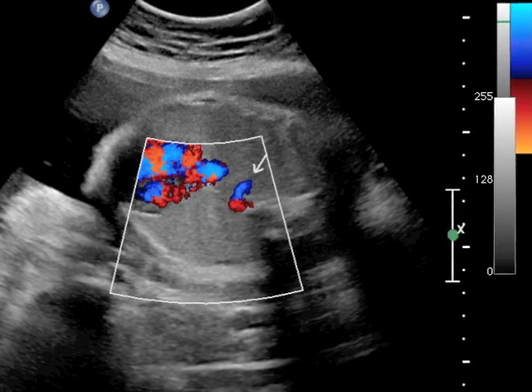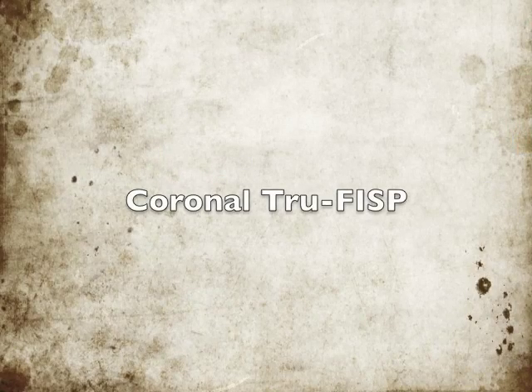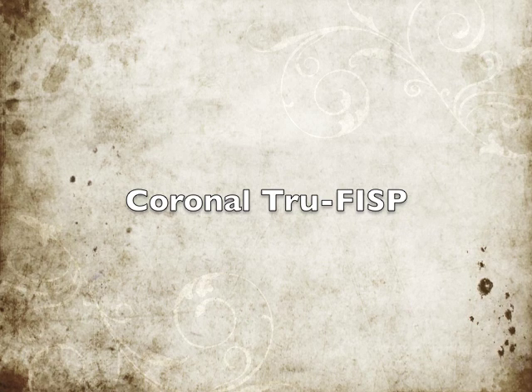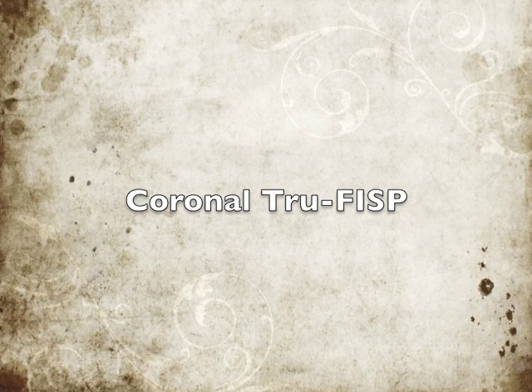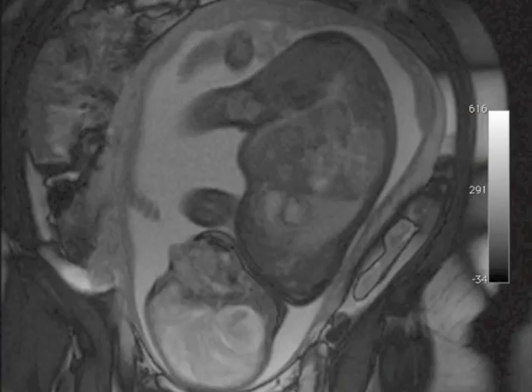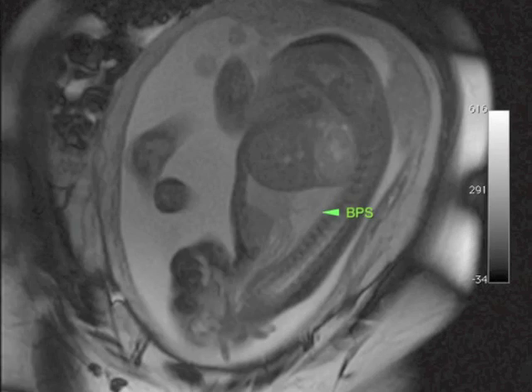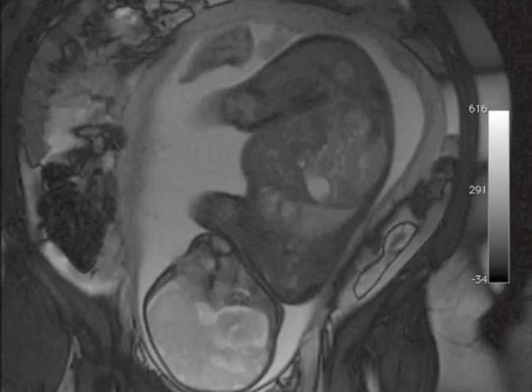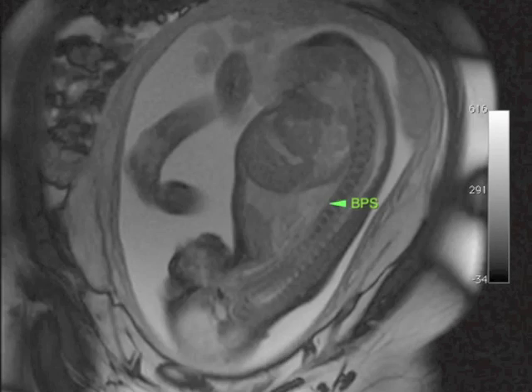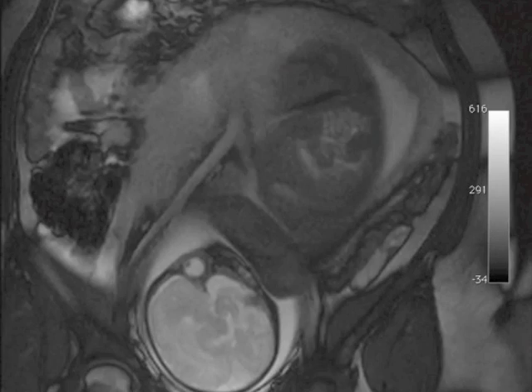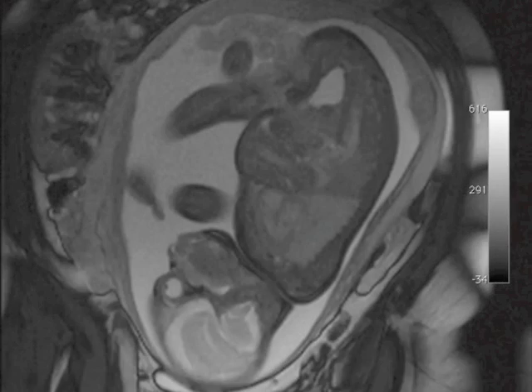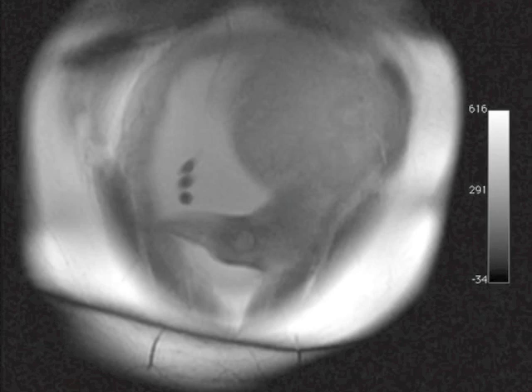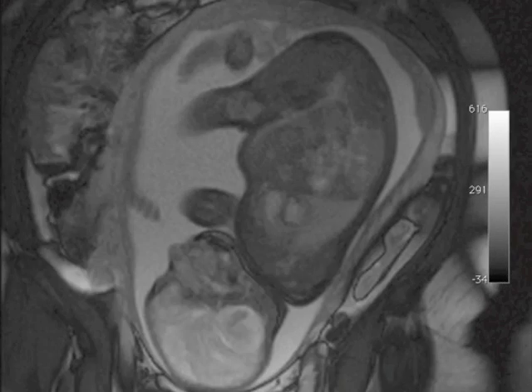After this was picked up on ultrasound, the mother went on to have a fetal MRI to further characterize this abnormality. A selected coronal image from the true FISP sequence nicely highlights the abnormality. The green arrowhead, labeled BPS for bronchopulmonary sequestration, is pointing to the wedge-shaped area of hyperintensity in the right lower lobe. Note that this segment is sitting superior to the much more hypointense liver.